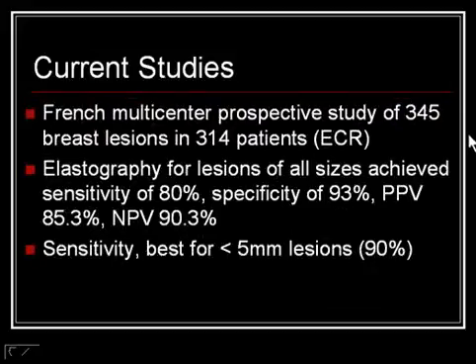There is a French multicentric prospective study utilizing 345 lesions in 314 patients. This was presented at the European Congress of Radiology. Elastography for the lesions of all sizes achieved sensitivity of 80%, specificity of 93%, and positive predictive value of 85.3%. The negative predictive value was 90.3%.